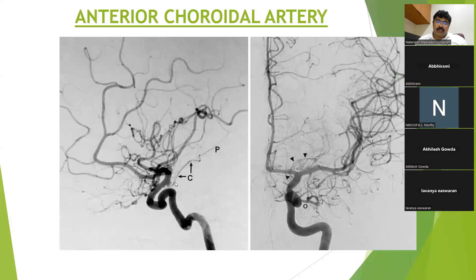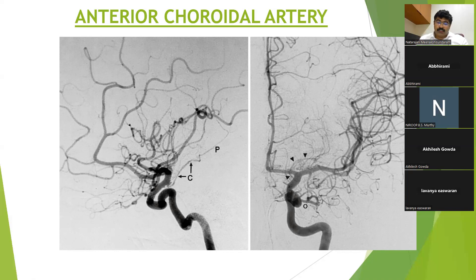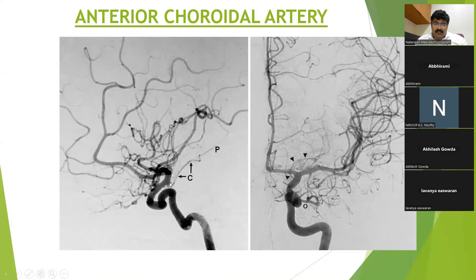A special mention on the choroidal artery: it is quite difficult to see the anterior choroidal artery and you need to spend more time locating it. The anterior choroidal artery has two segments — the cisternal segment and then the plexal segment.